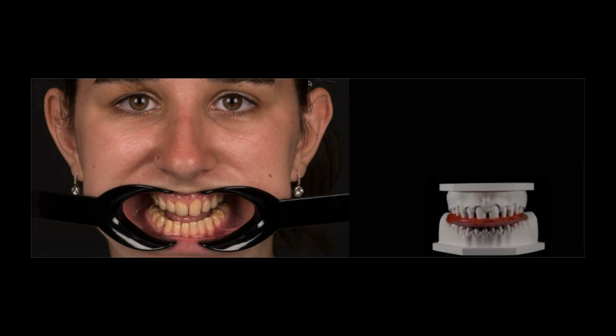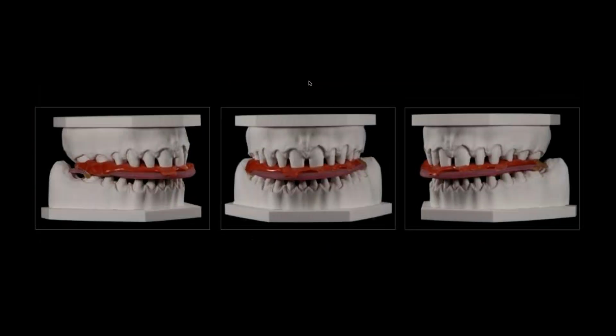Because based on these pictures, as I said, I always prepare my study models. I grind the base of the model parallel with the bipupillar line, just so that I have the right angulation of the model, and then you will see I try to mimic the correct midline, and then these are my models ready for waxing up.